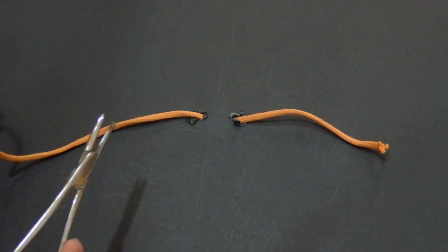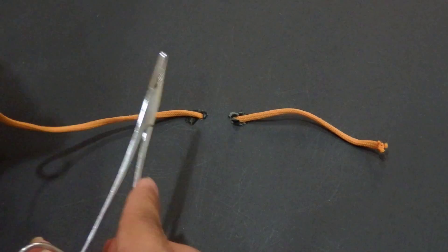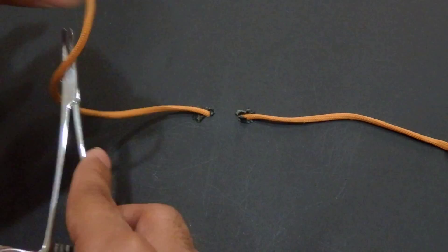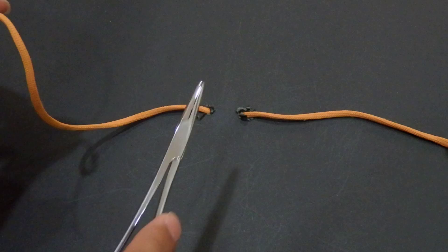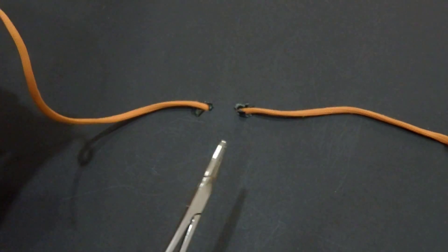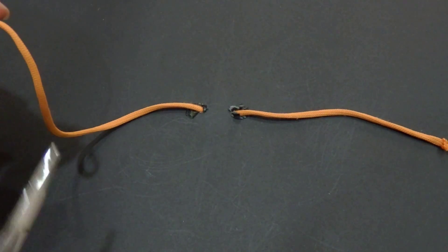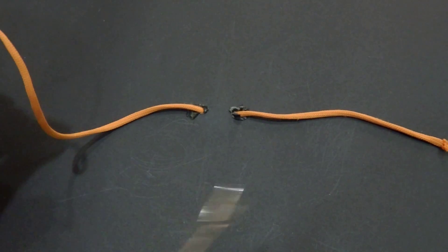The fourth common mistake, which is usually confusing, is that they forget whether they have started from inside or from outside. If they started the first knot from inside — meaning between these two loops — they have to continue the other knot from inside as well. And if they started from outside, they have to continue from outside, in order to get a square knot and avoid the granny knot.